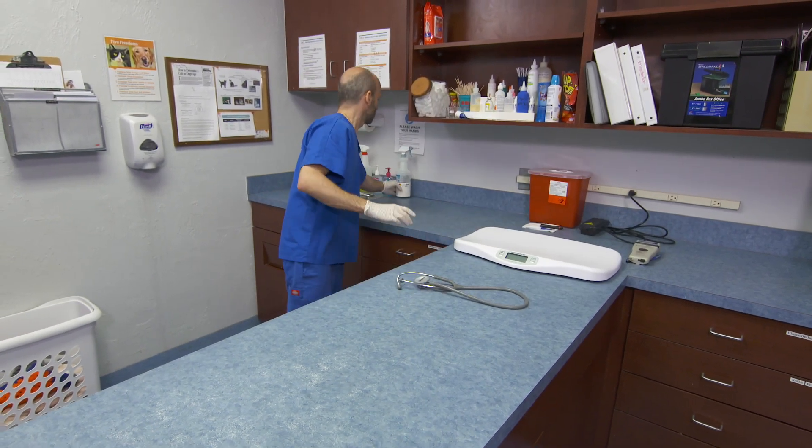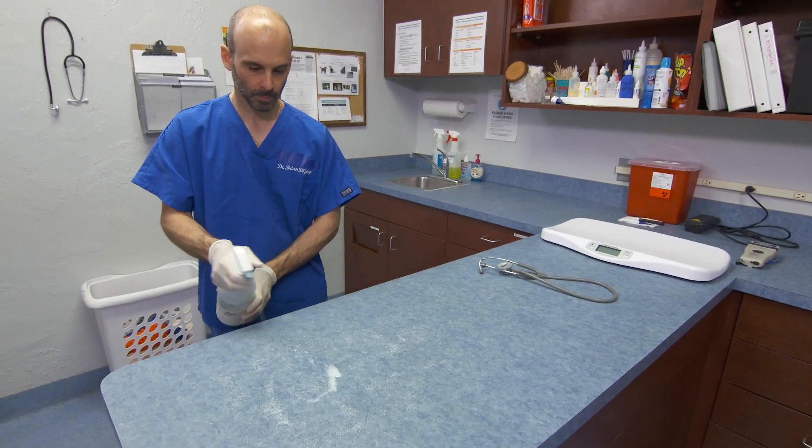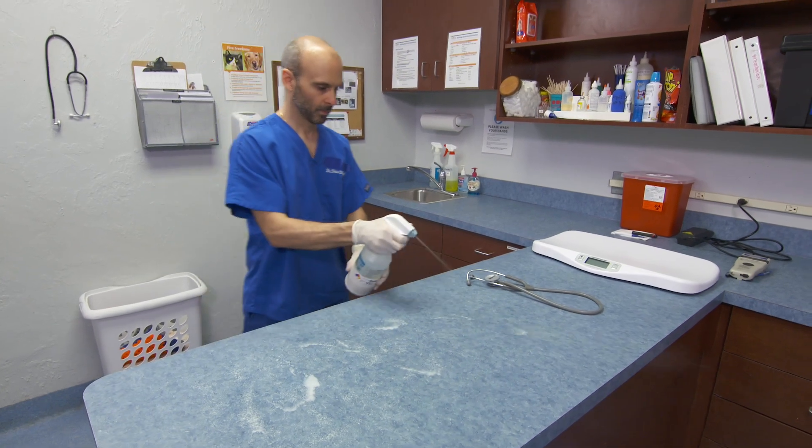When sampling is complete, the examination area should be cleaned, disinfected, and prepared for the next patient.